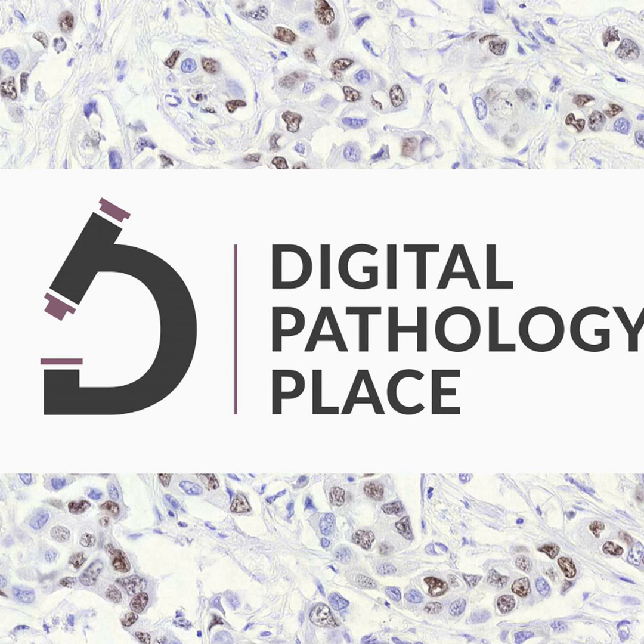B. Clinical trials. Traditionally, in multi-site trials, the transportation of physical pathology slides from various sites to a central lab for review can be both time-consuming and risk-prone. The logistical challenge is effectively addressed by digital pathology. Again, this was the reason Dr. Weinstein developed telepathology in the first place. Digital pathology allows for making the pathology slides readily accessible for review from anywhere without the need for physical transportation. This not only saves significant time, but also reduces the risk of slide damage and loss.